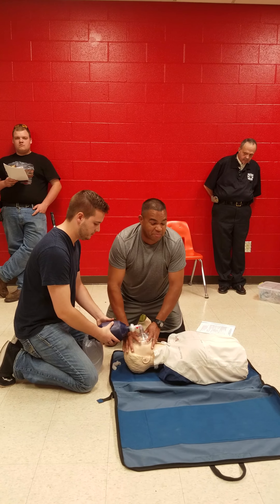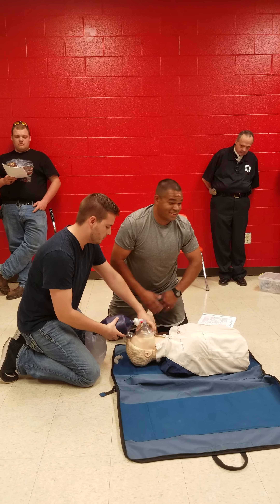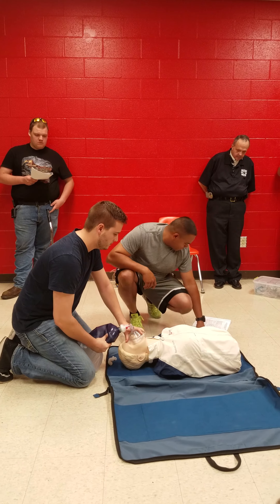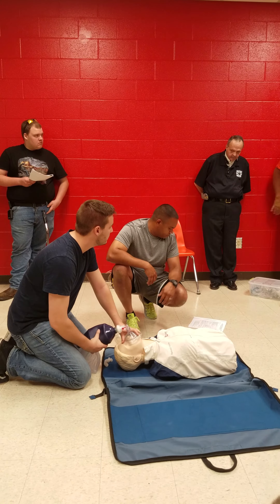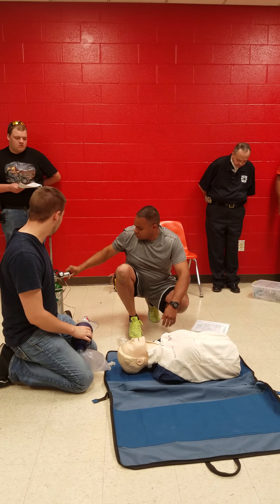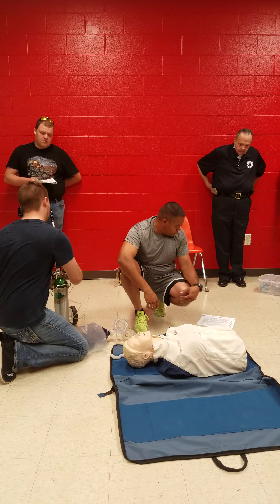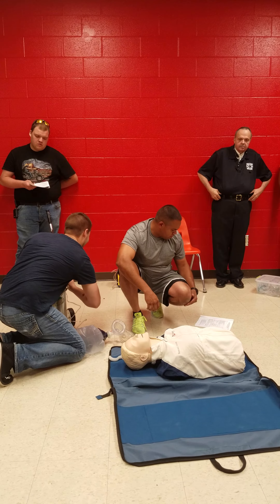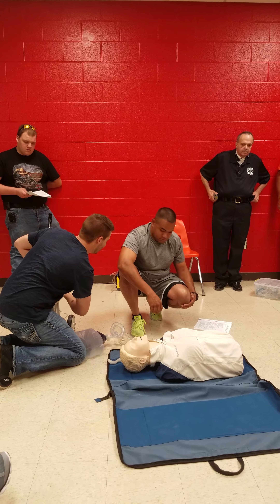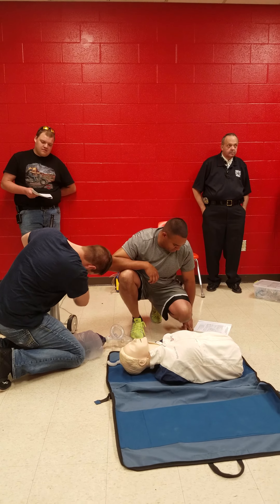I'm going to have my partner pre-oxygenate while I lay my patient. That leads right into the next station — the King Airway. Because the first thing you have to do is pre-oxygenate your patient for two minutes before you ever try to insert the King Airway. It's going to take you some time to set it up, so you want to make sure your patient is well-saturated with oxygen before putting the King Airway in.